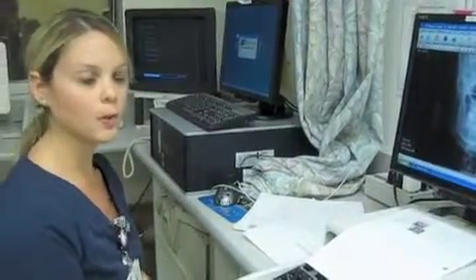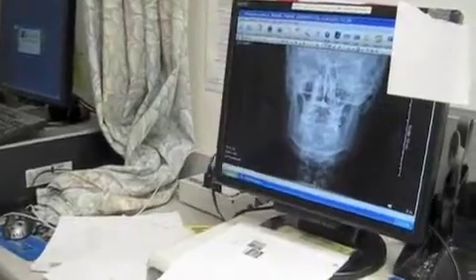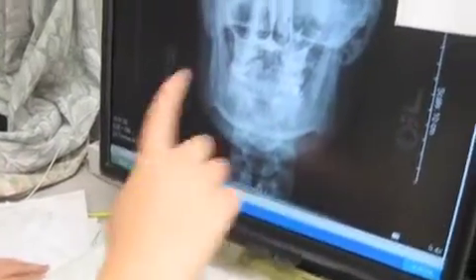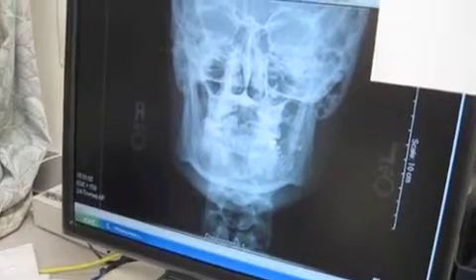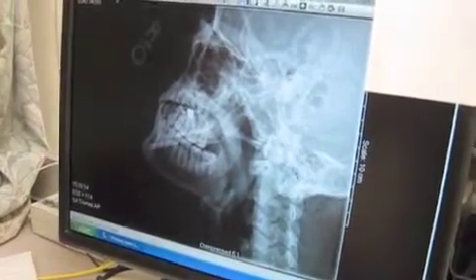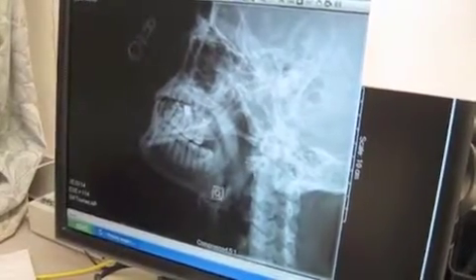Okay, so now I'm finished with the mandible series, and I'm going to critique the images. And also for the mandible series, we do 75 kV at around 5 to 12 mAs. For the first picture, this is our PA. We're looking mainly at the mandibular body, which is in here. For our next views, we did our right and left obliques. This also again shows the body here.